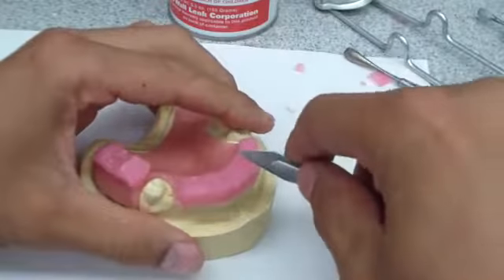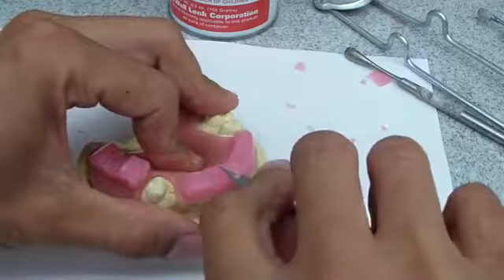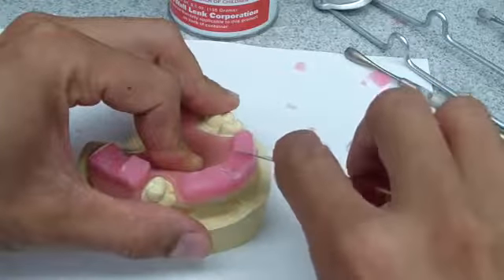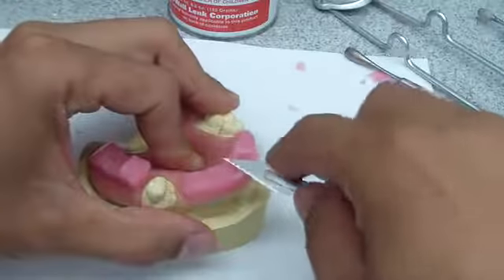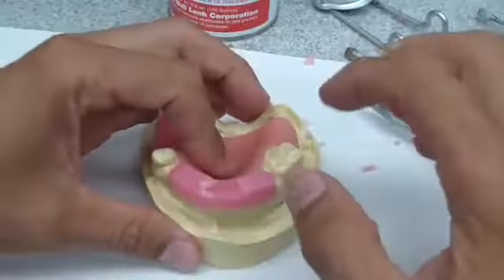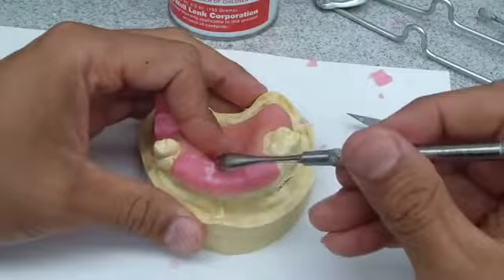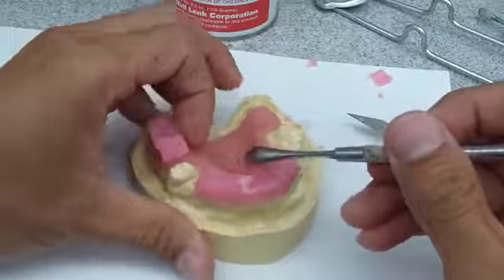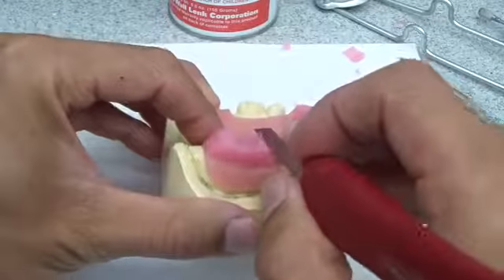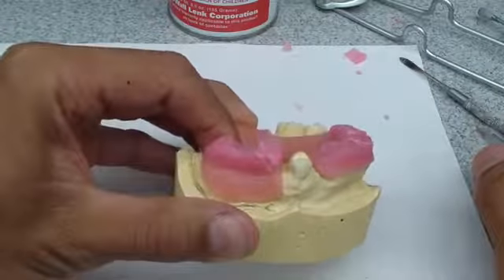Now, one of the problems when you layer this, I was just doing this, is that when you layer the base plate wax, it's great, it comes off like that, but so does the rest of it. It'll come flying off. So one of the things to prevent that is either use a full block, the prefabricated blocks and not layered, or just heat it up with a wax instrument and remove this, and then sharpen it up so you have an undercut similar to this, in an effort to retain your Blue Mousse.